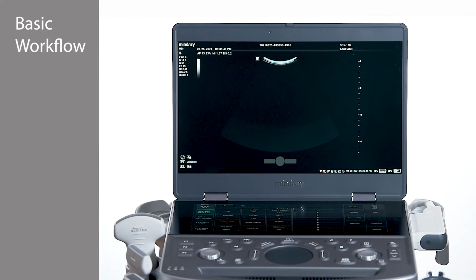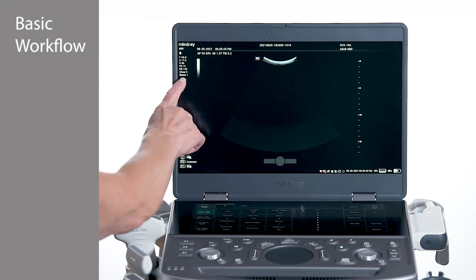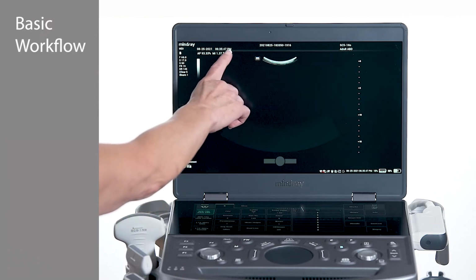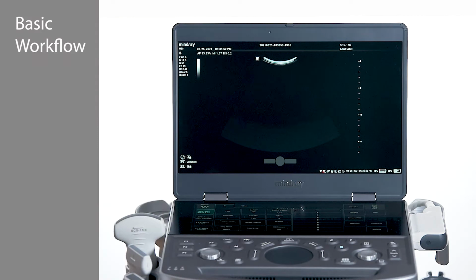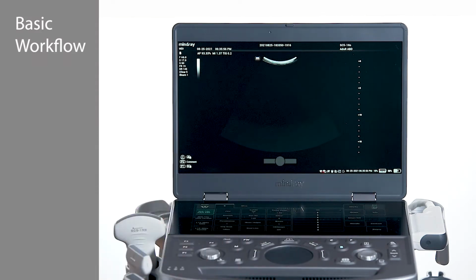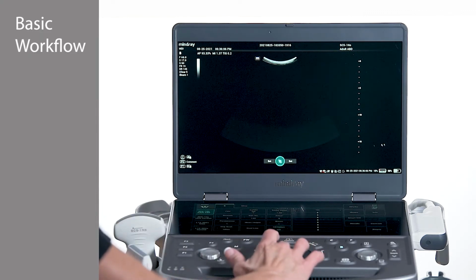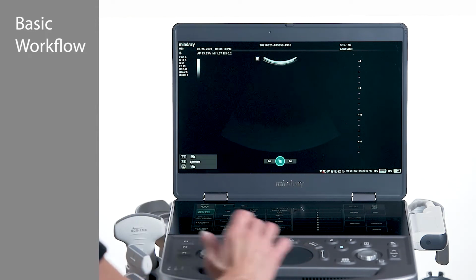The information banner along the top of the monitor includes the transducer and imaging parameters, the patient data, exam, and date and time. There are also a set of icons along the bottom right which provide information about wireless, task management, the recycling bin, hard drive capacity, and battery status. Use the cursor and trackpad to select these items. Along the bottom left of the screen, programmable key functions can be viewed.